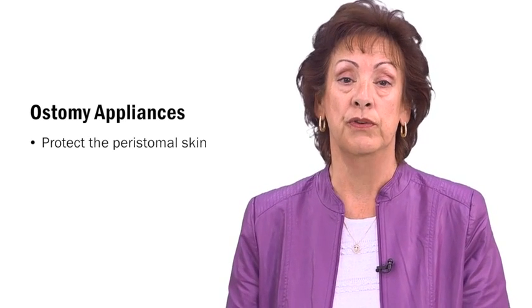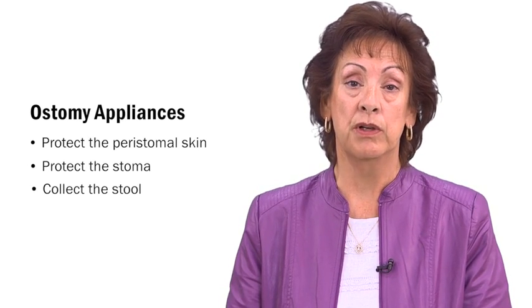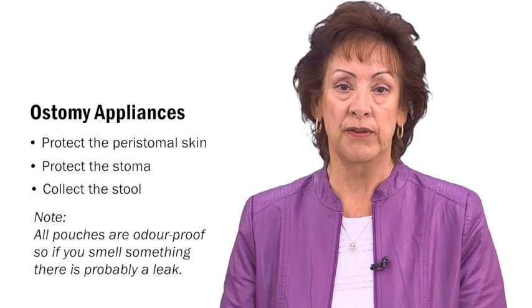The purpose of putting an appliance on an ostomy is to protect the peristomal skin, which is the skin closest to the stoma, protect the stoma itself, and to collect the stool. All pouches are odor-proof, so if you smell something, there's probably a leak.